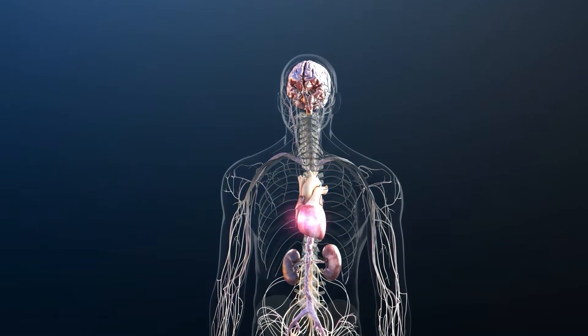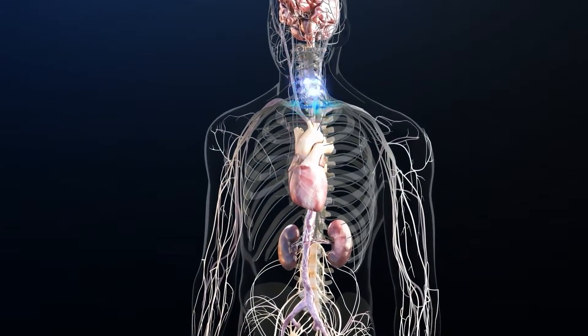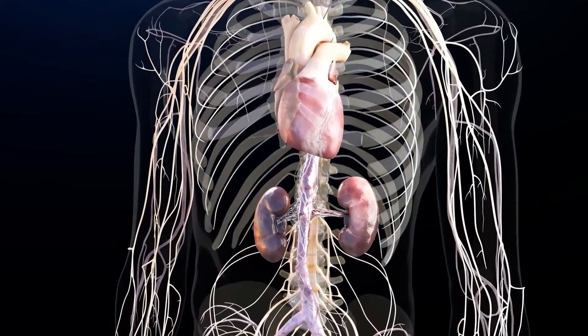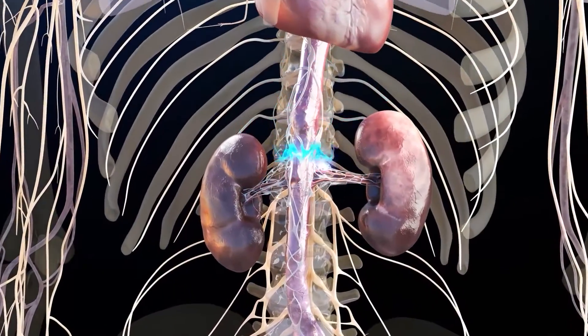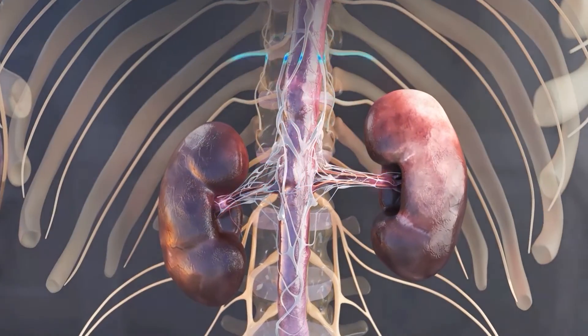Overactivity of the renal sympathetic nervous system is a major contributor to hypertension. Studies have shown that denervation or elimination of the sympathetic nerve pathways along the main branch of the renal arteries to and from the kidney can reduce blood pressure.